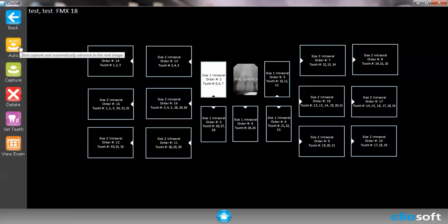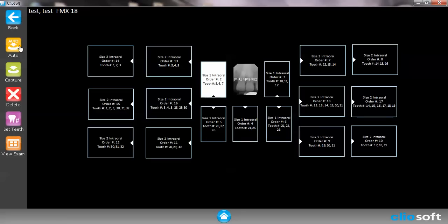That way you can simply just place the sensor, click the button and the placeholder will automatically move to the next one. So you could just simply move the sensor again, click the button and take the whole full mouth series. Usually an FMX series will take anywhere from seven to eight minutes.